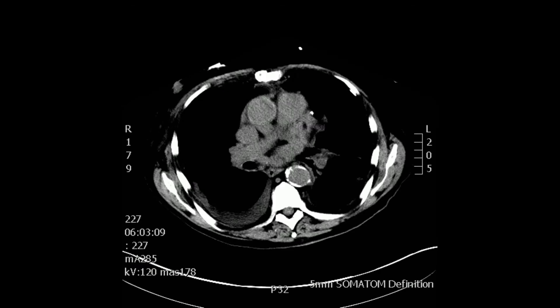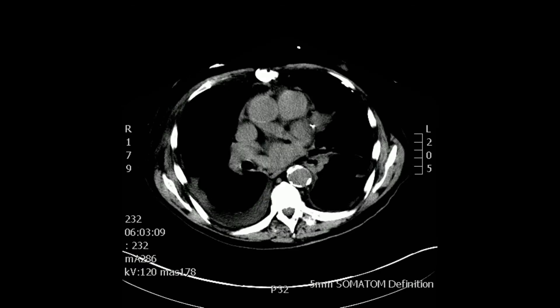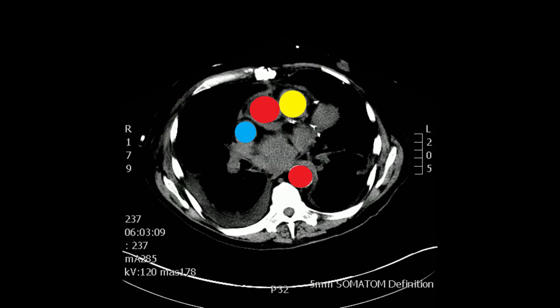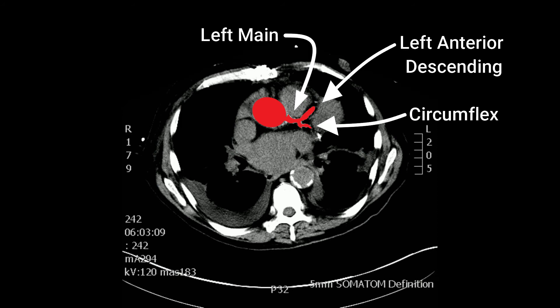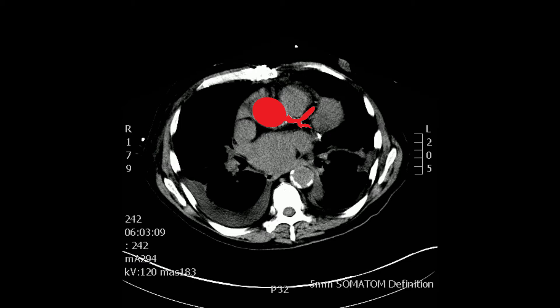Again, the mediport as it disappears, and the superior vena cava in blue, ascending aorta, main pulmonary artery in yellow, and descending aorta posteriorly in red. You can see the left main coronary artery with its left anterior descending and circumflex branches arising from the aorta — heavily calcified left main and branches.